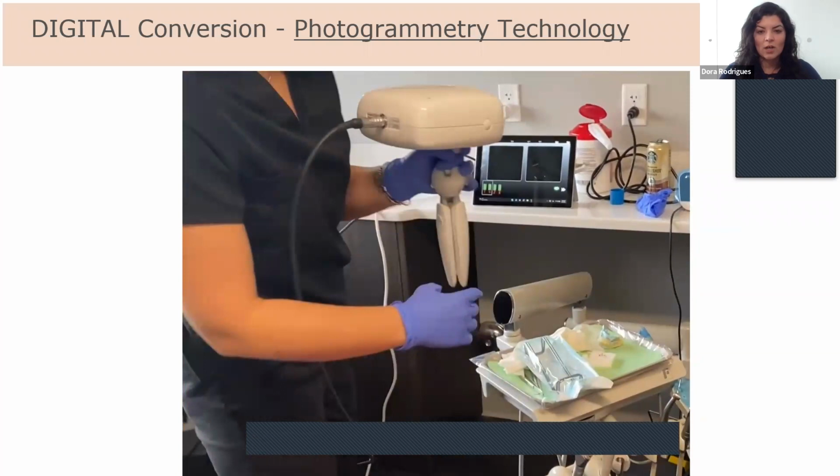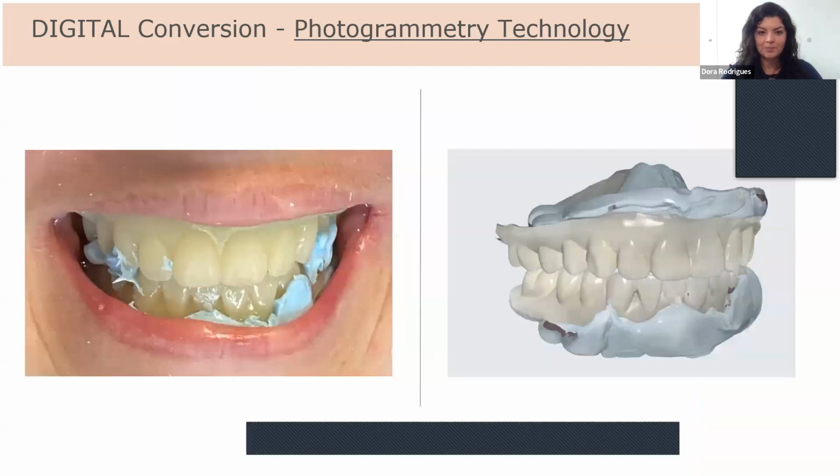That's it. So I really love the entire workflow just because it's fast, it's easy. Once you nail the design and merging data and everything else that you need to know, it makes these cases a lot more predictable, and it's just faster overall to get this done. And capturing the data is what's fascinating because it's really fast.